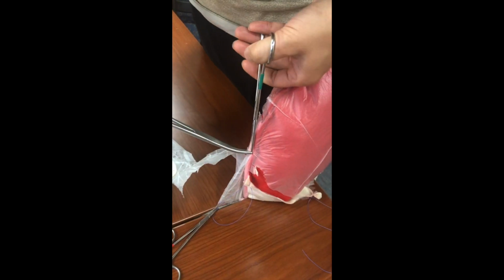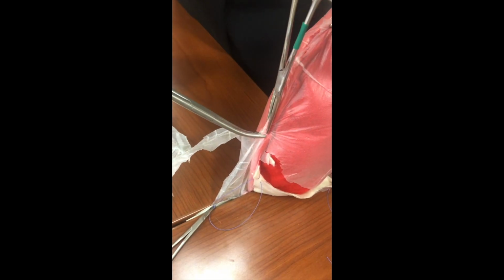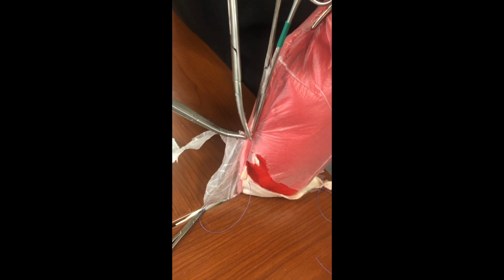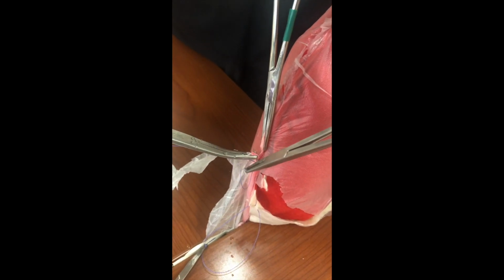To begin dividing the uterine artery, place a straight Kocher for back bleeding about 45 to 90 degrees above the Heaney clamp, as shown here. Use curved Mayo scissors to cut between the Heaney and Kocher clamps, leaving tissue on the Heaney. Then suture ligate the pedicle as shown here.